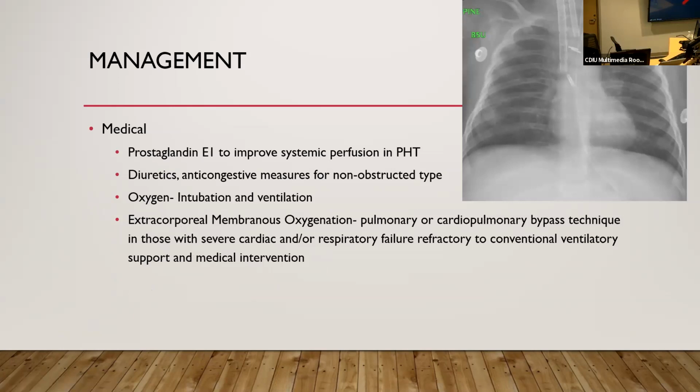This particular patient that we've had to do ECMO on, which is a cardiopulmonary bypass technique in those with severe cardiac or respiratory failure refractory to conventional ventilatory support and medical intervention. So in this case, this patient was on a peripheral VA ECMO, whereby you have your arterial line and your venous line going into the superior vena cava.